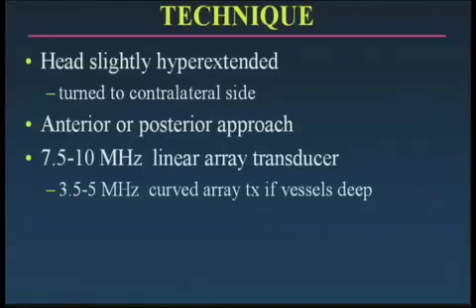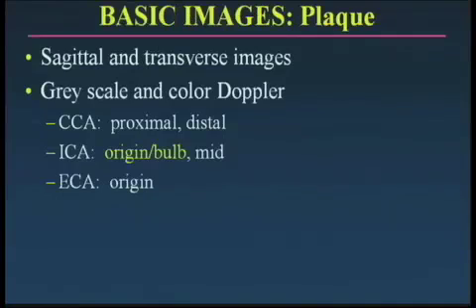Now, in a patient who has a short, thick neck or deep vessels, we sometimes have to use a lower resolution, lower frequency curved array transducer in order to visualize the vessels.